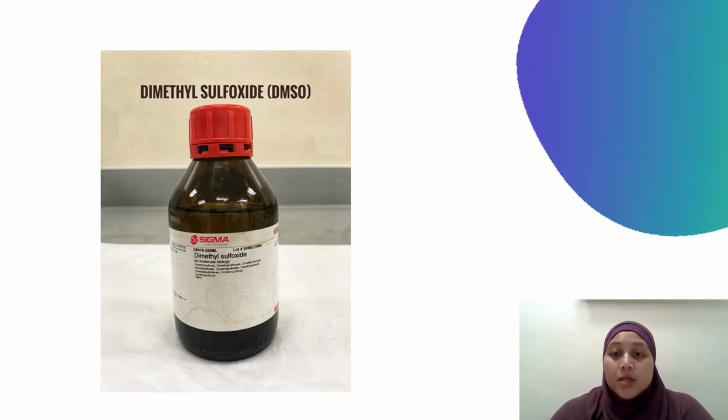In laboratory practice, DMSO is used to dissolve a drug compound and also for cryo-freezing media or cryoprotectant. Normally, we add 10% of DMSO at the concentration of 100% into our working media, and this will prevent intracellular and extracellular crystal from forming in cells during the freezing process. This crystal can cause cell death and can't be used for transplant or cell culture work.